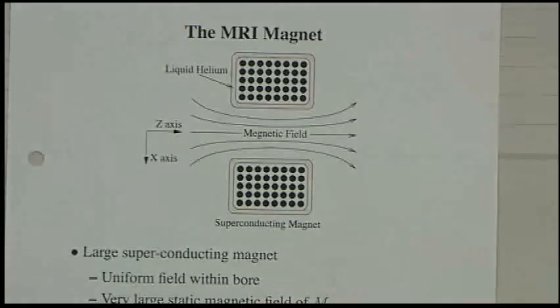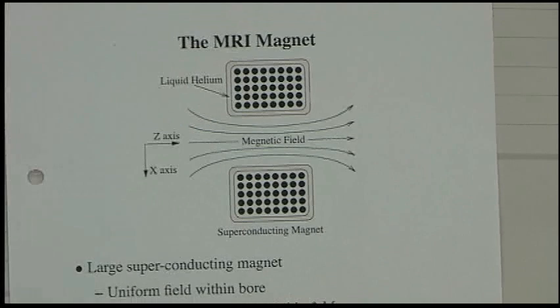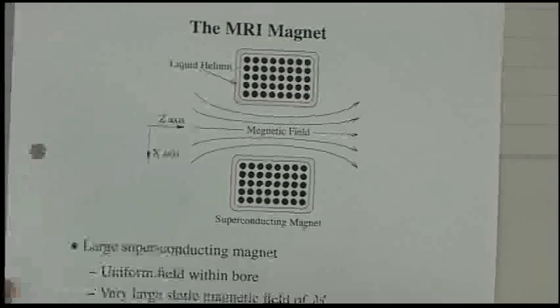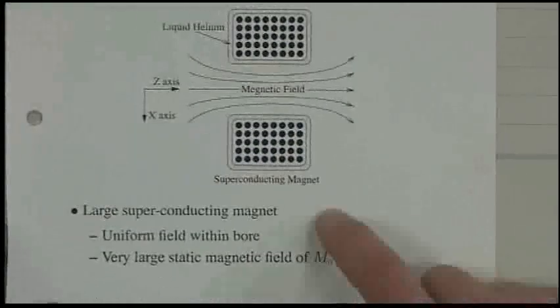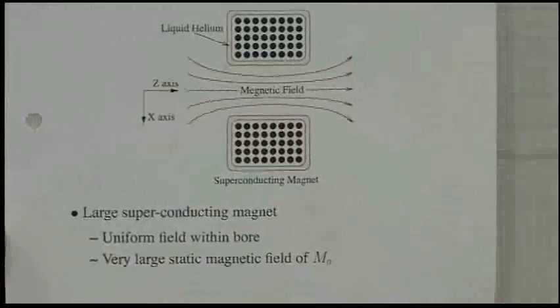And so it is actually a serious safety concern. They have to have oxygen nearby, and it's best if the doors open outward, because otherwise the doors can become pressurized in a closed state. So I think that's kind of fascinating myself. But anyway, the upshot is you've got a magnet, and it's a really, really strong magnet.